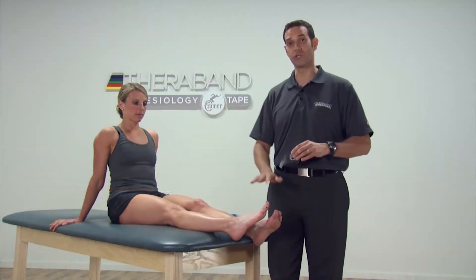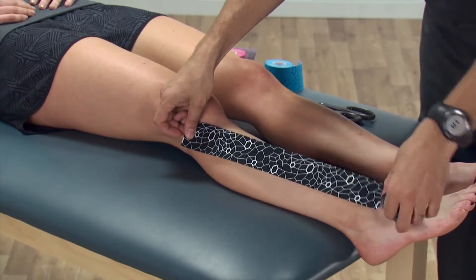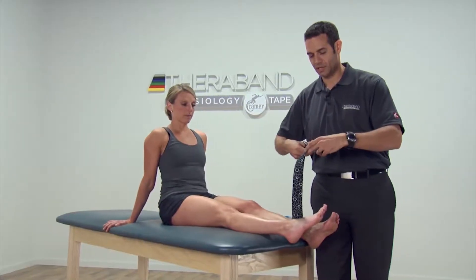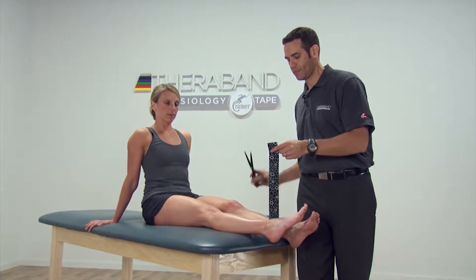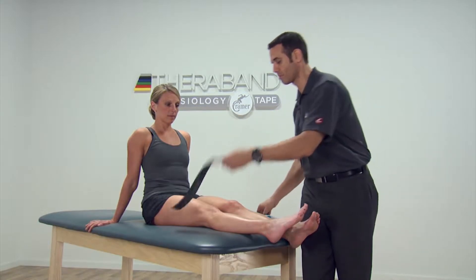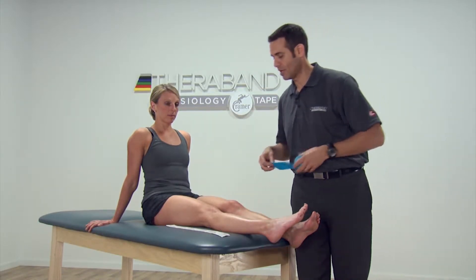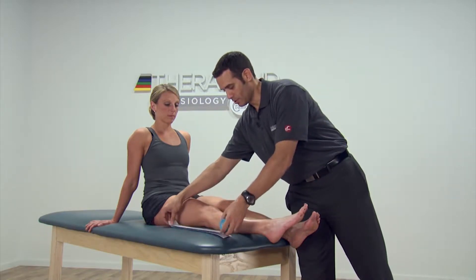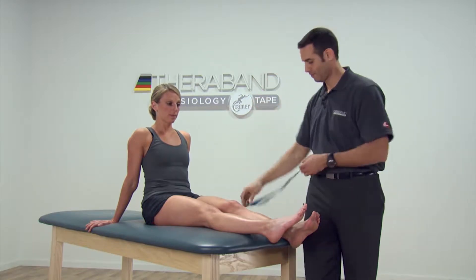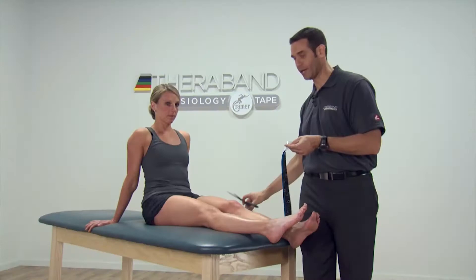In this case, we're going to do a standard lateral ankle sprain taping, and we're going to measure from the lateral corner of the knee to the dorsum of the foot. With this one, we're going to cut four tails, but since we're going to demonstrate this using two strips, I'm going to measure two equidistant strips, and this way we can cut all the tails at one time.